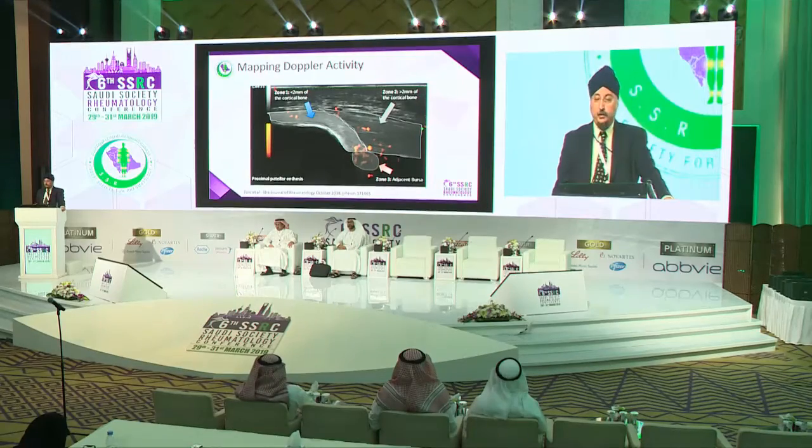So by being neutral, we can record Doppler activity right next to a bone, and then greater than 2 millimeters, and then also look at adjacent structures in the fat pad, in the bursa. And in 2019, there are at least 3 papers who are now doing this, which are challenging our OMERACT colleagues. And so this is not new.